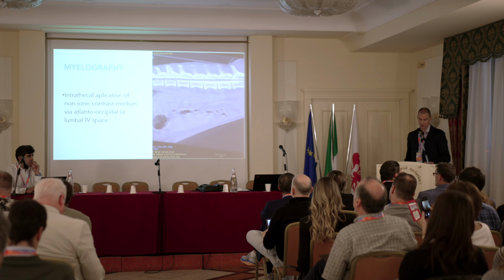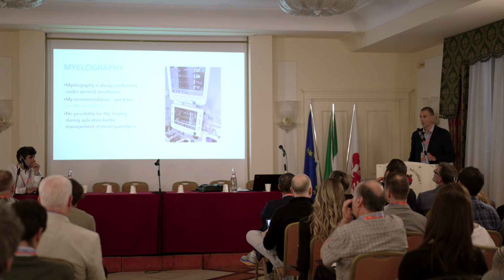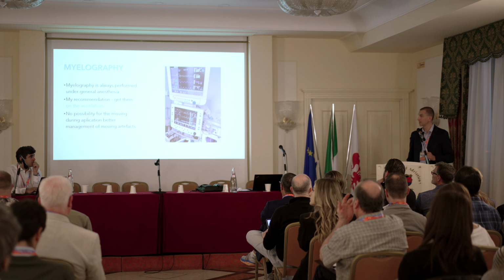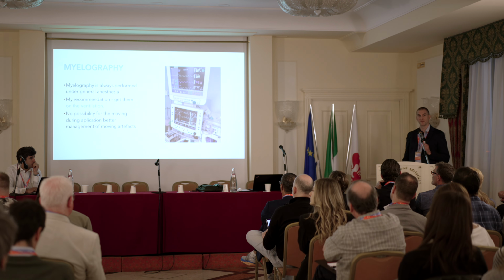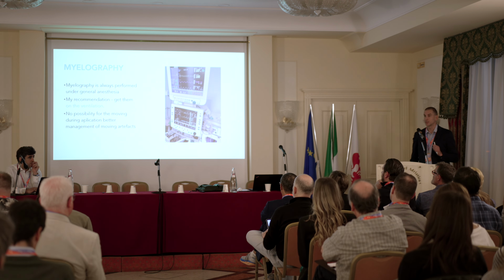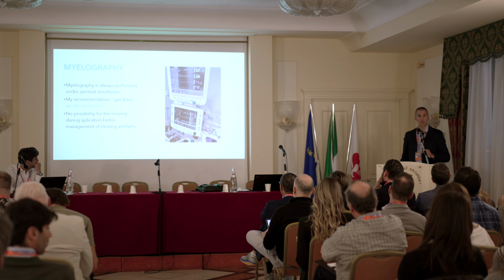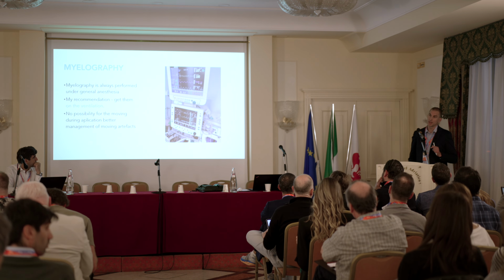For myelo studies, I put all those cases under general anesthesia. All of them are intubated and all of them are ventilated. I use pressure control or volume control ventilation, and for those cases I don't use apnea, but for some thoracic studies it is better to achieve apnea.